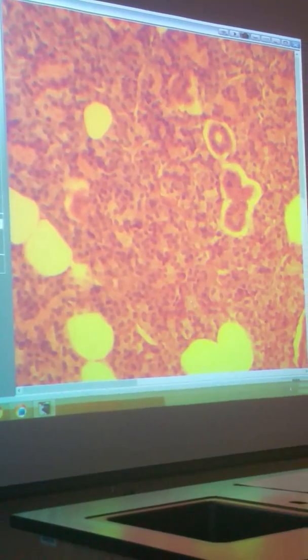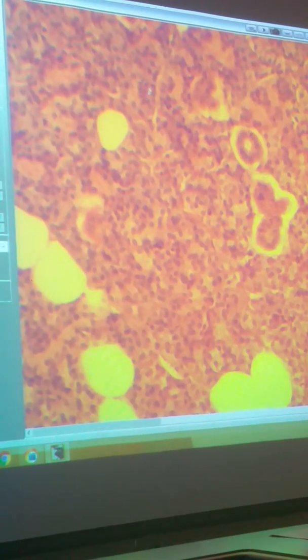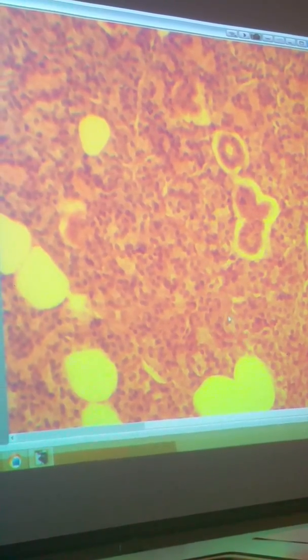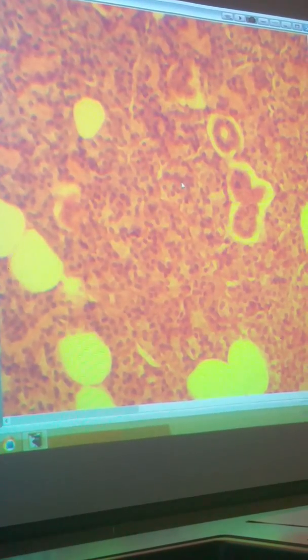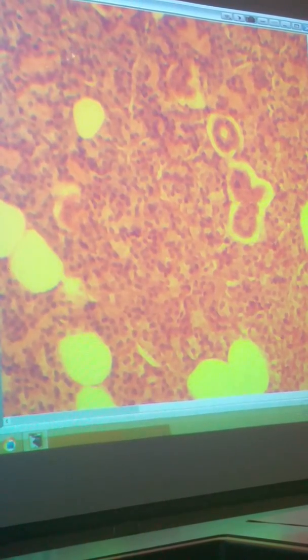You see some whitish grayish areas right here, but for the most part you also see these dark pinkish areas as well, right? It's the parotid gland. If you had to compare this, this one's supposed to be the submandibular. The only reason we'd say it's submandibular is because you have some mucus secreting cells, or mucus acinus, and you also have some that are serous acinus.